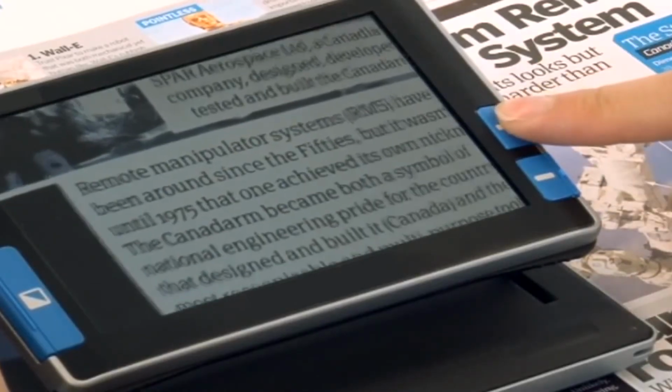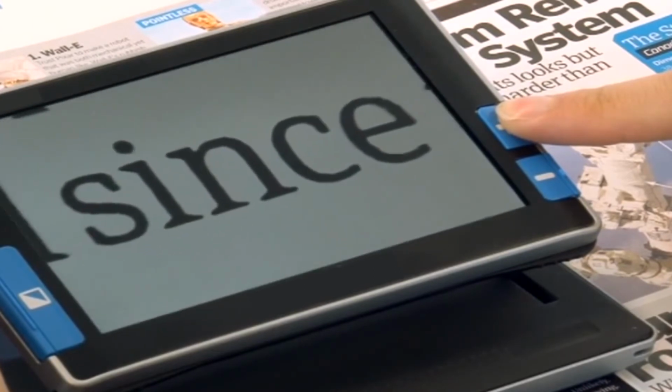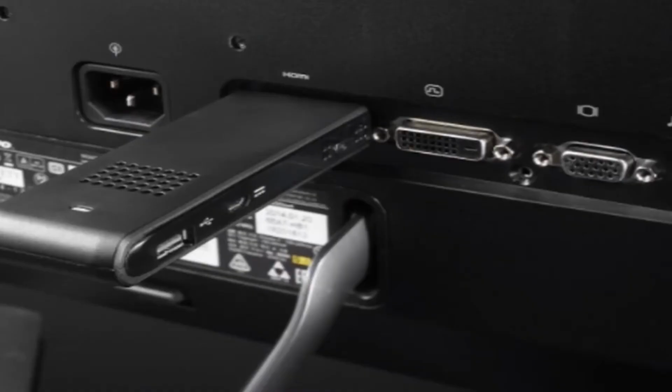A freeze mode option is available for capturing the image for easy viewing like a digital camera, and nearly 200 images can be stored. The person with low vision can transfer these saved images to the computer with the help of a USB converter for easy viewing. The distance viewing feature is also available in some of the advanced electronic video pocket magnifiers.